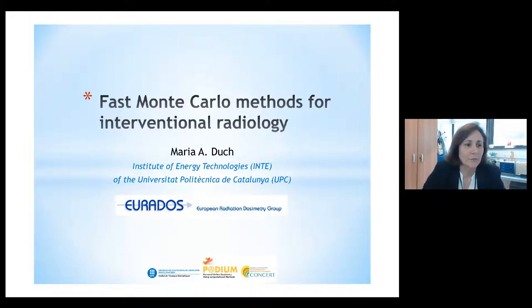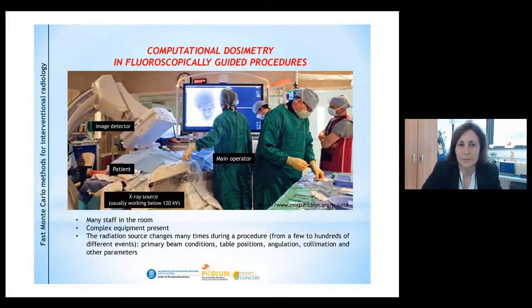In this situation, you have a picture of a typical situation in this kind of medical procedures. What we have is many staff in the room. As you can see, we can have four, five, six persons in the same room. The room is full of many complex equipment. And also we have the situation that, of course, the medical staff is moving all the time, not too much, but it moves and orientates in a different way against the radiation source. And the radiation source is usually an X-ray system that changes many times its working characteristics during a whole medical procedure.